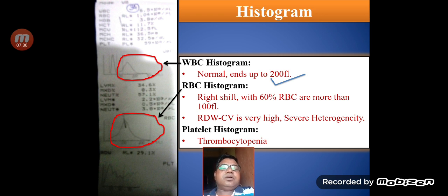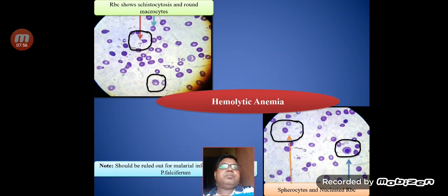The RBC histogram is totally shifted towards the right, most cells are macrocytic, and there is a high degree of variation between these cells, resulting in high RDW-CV. The platelet count is also low. On the peripheral smear of this patient, we can see the presence of schistocytes and round macrocytes, along with nucleated RBCs and spherocytes — findings commonly seen in hemolytic anemia. Even before seeing the smear, we can diagnose this condition by knowing the histogram changes.